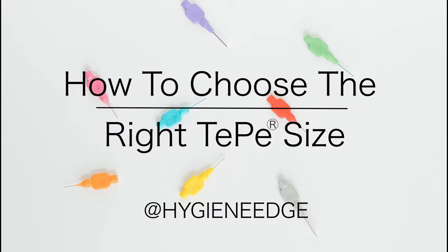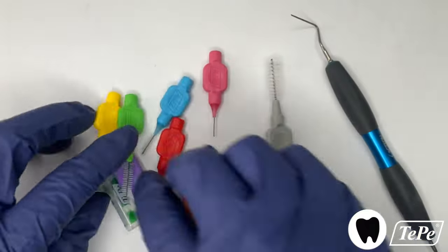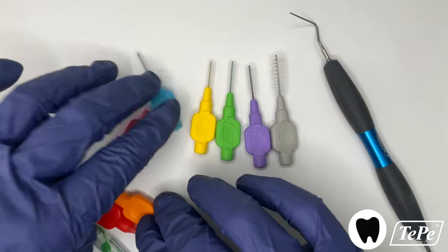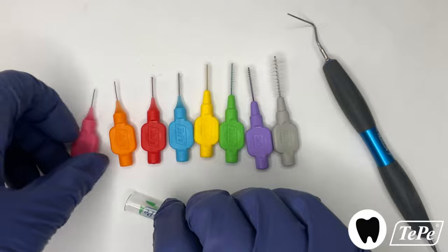These are Tepe interproximal brushes, and when used right, they remove more biofilm interproximally compared to floss, which improves overall oral health. Tepe has many sizes, as not one size fits all teeth. It's important to get the right fit for proper removal of biofilm.